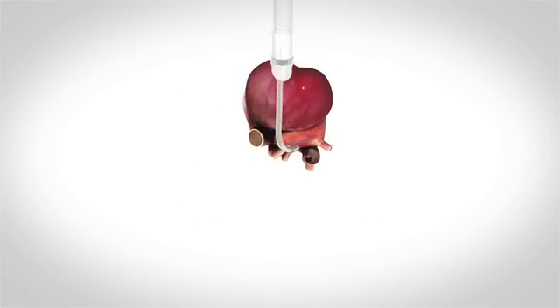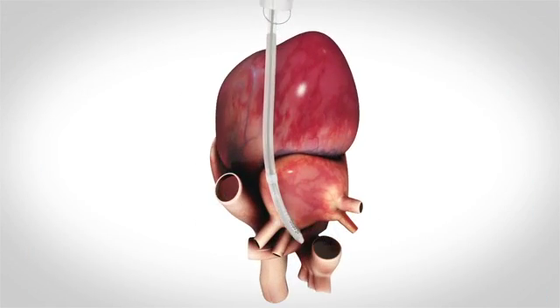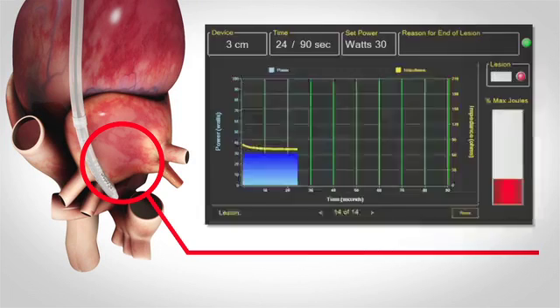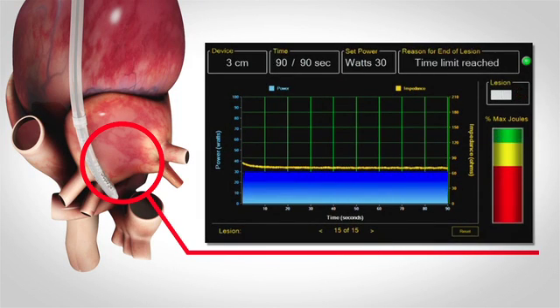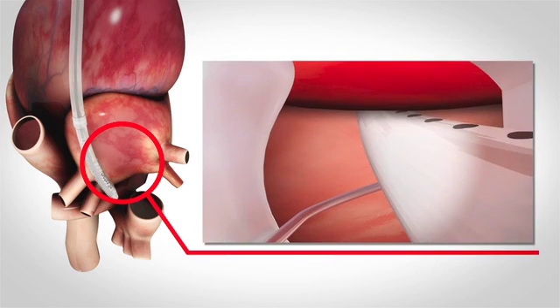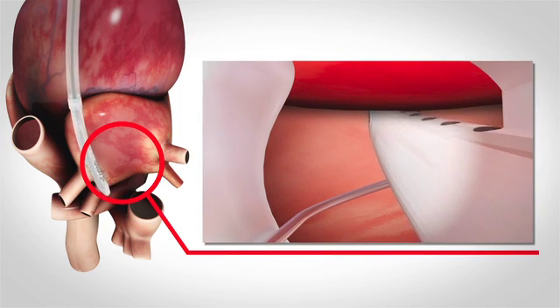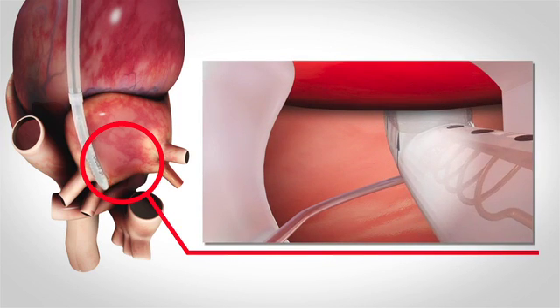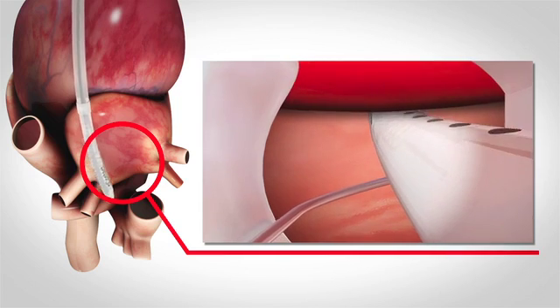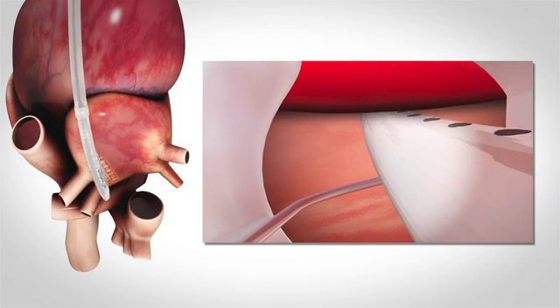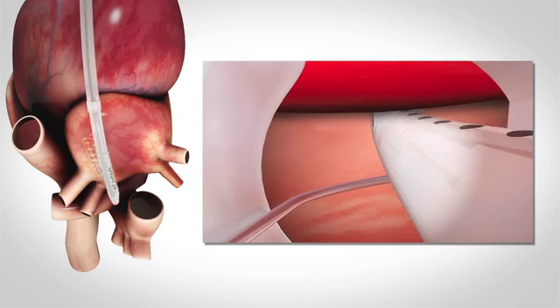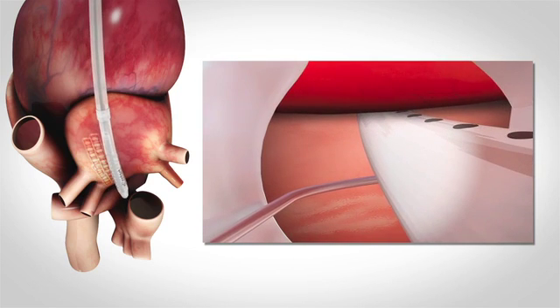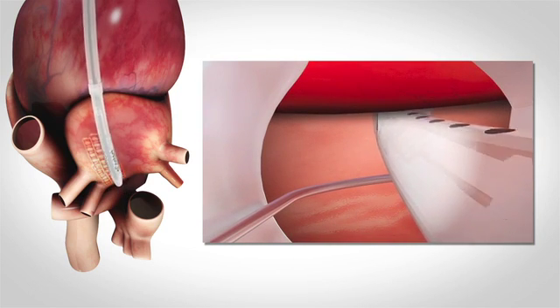You're going to create a series of lesions with the ablation device distally and proximally so you're ablating as much of the posterior left atrium as possible. It won't have just a single row — you'll typically have two rows or even more to make sure you're ablating as much of the posterior left atrium as the physician wants. You're going to go in and create the posterior ablation from the right pulmonary veins to the left pulmonary veins, making sure that you're happy with the lesions.